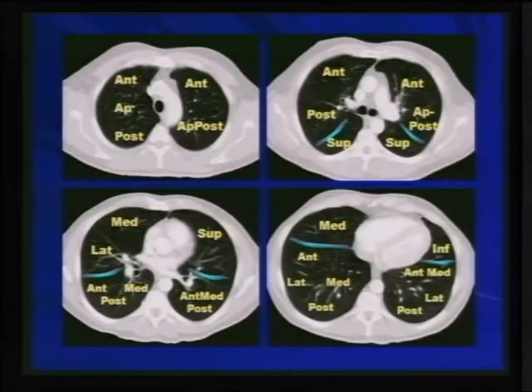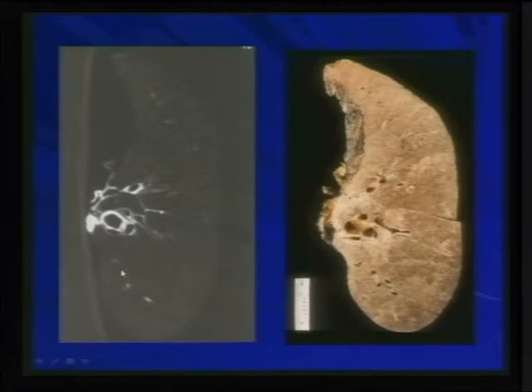And when you look at the lung tissue on a CAT scan, the same thing, as you do see some few dots and some few lines, and you do see sometimes the fissures, but they basically just like branches coming out of a trunk and then spreading toward the periphery of the chest and then branching and becoming thinner.